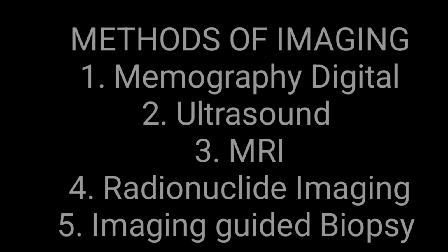Multiple methods have been used for the detection of breast abnormalities. These are called imaging techniques. The topmost, valid and reliable technique for breast abnormality is mammography. Digital mammography can also be used with the help of MR and even sometimes CT, but digital mammography is one of the basic and primary tools to detect abnormality of the breast.